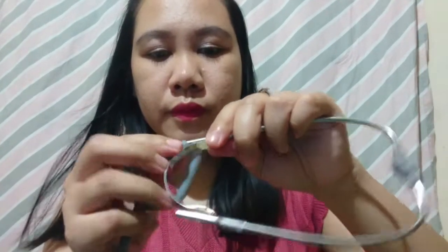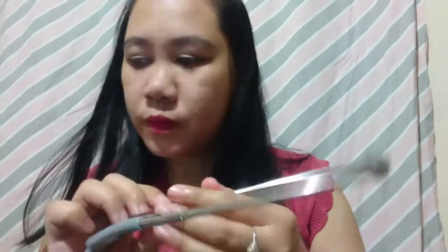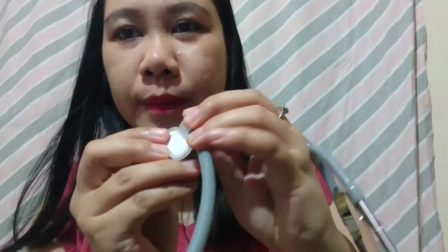Let's go and connect this. This is where you are going to put your name — this is the ID name tag. This is the diaphragm. This is the stem.